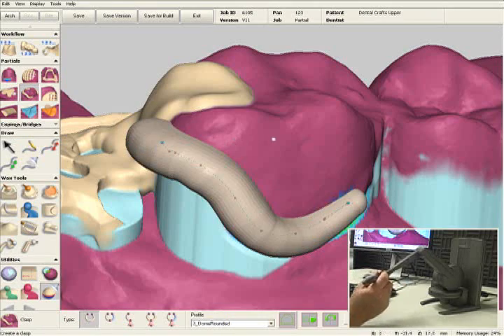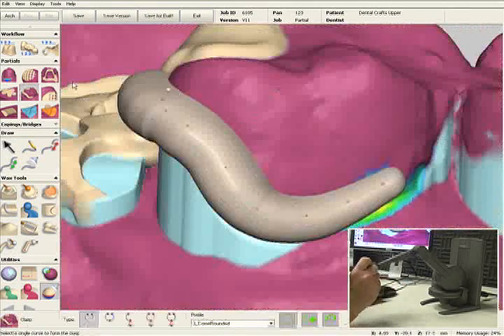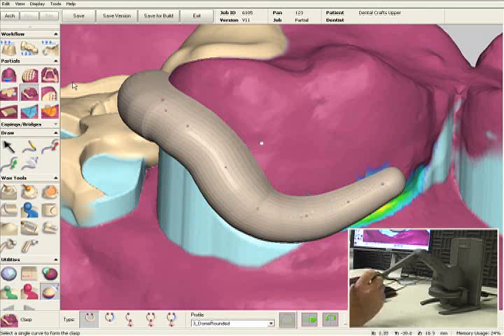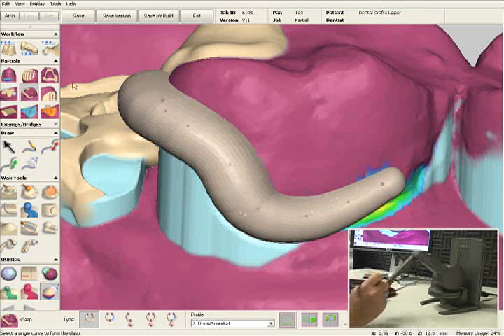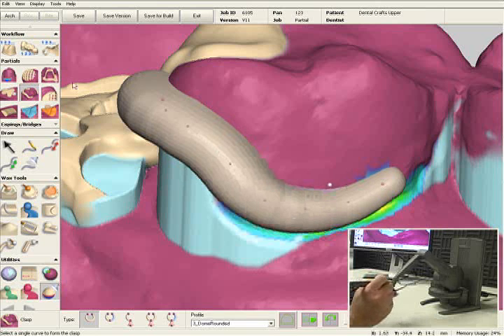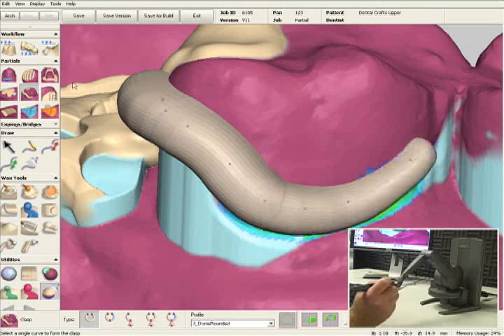Now we have a three-dimensional preview. All the points are still visible, so if I'm not happy with the shape of the clasp I can always move the points around to change it. If I wanted to make it longer I can move the end of the clasp towards the distal of the molar. If I wanted to make it shorter, I'll move it towards the mesial.